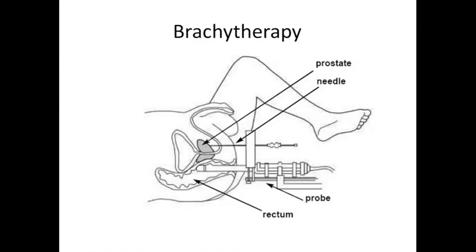And then on the morning of the treatment, people come to the admissions unit first thing in the morning. They meet myself or my counterpart, Dr. Nick Pota, who does the prostate brachytherapy with me. He and I do it for the patients in Sussex. And then we do the consent process and you meet the anaesthetist. And then you go around to the theatre room and go to sleep.